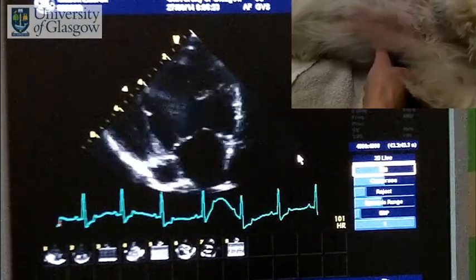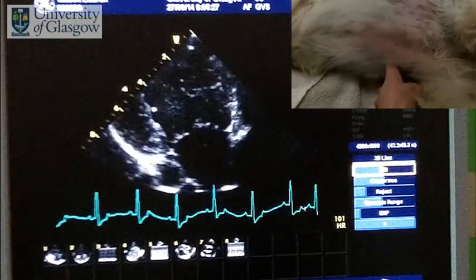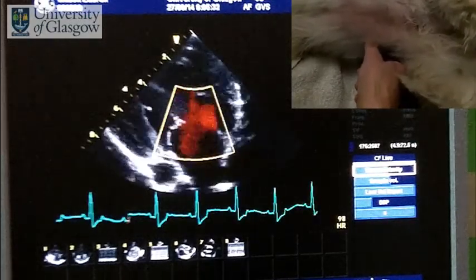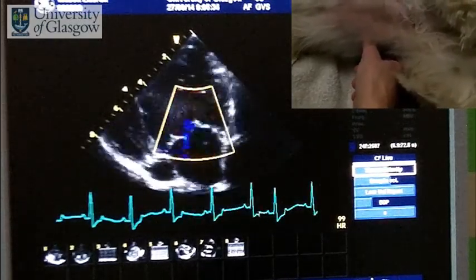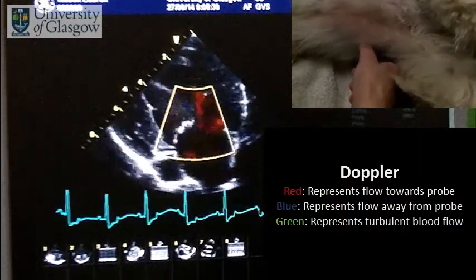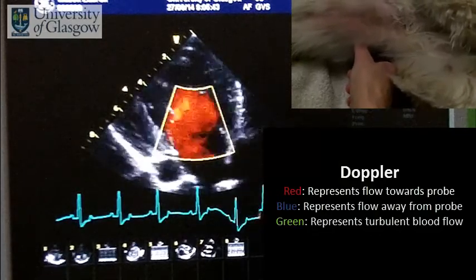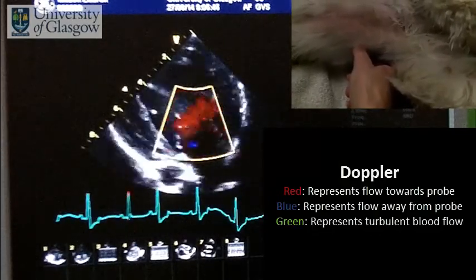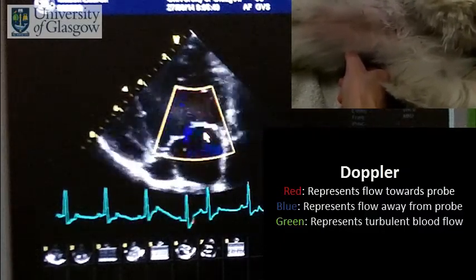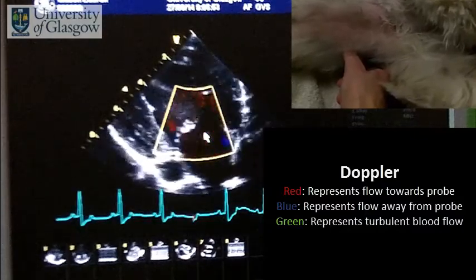We can now look at the morphology of the mitral valve, but we can also put the color on to see if there's any sign of abnormal flow across the mitral valve. We can see the red flow, which is flow towards us from the left atrium to the left ventricle, but we can also see a little flash of green — and that's a tiny flash of mitral regurgitation, so a very slight leak in that mitral valve.